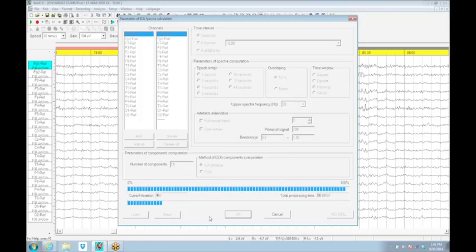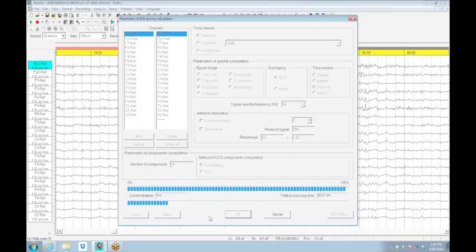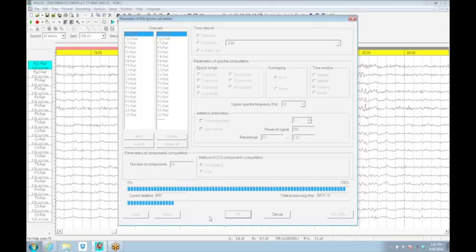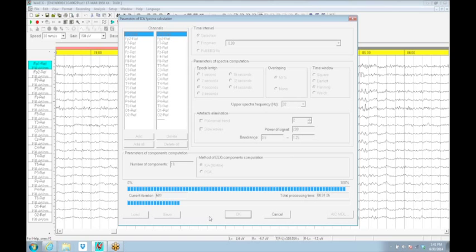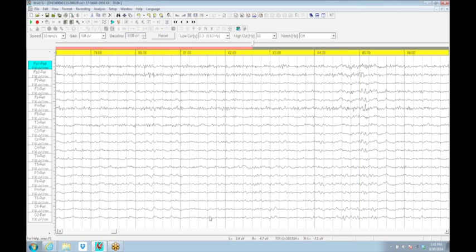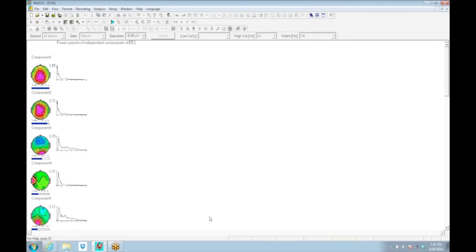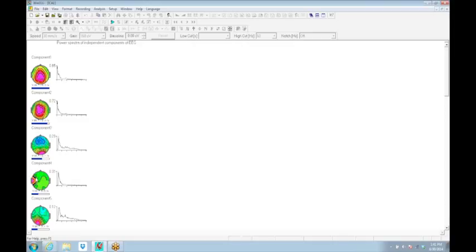Once it's completed with its learning of the spatially distinct generator patterns, we'll be able to look at them as components that make up this EEG. We'll be able to see them as isolated components. We can find their generators with Loretta and all sorts of higher level of analysis. This is a piece of this freeware that's available. It's a very high-level computational analysis. It takes time because of how intensive it actually is and the exact nature of this specific EEG.